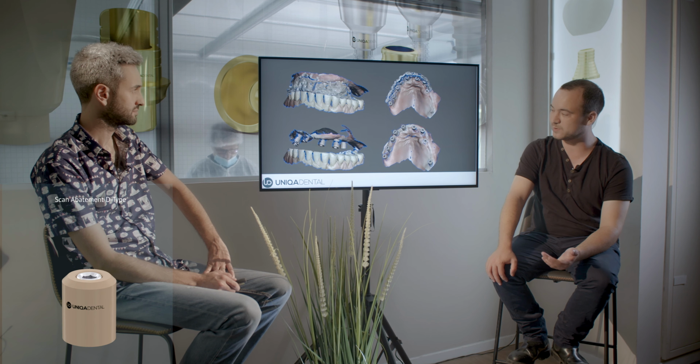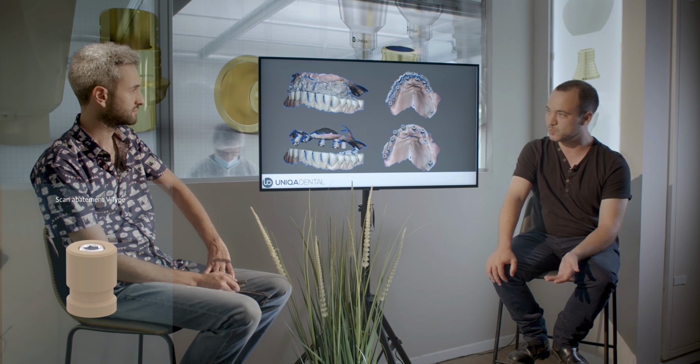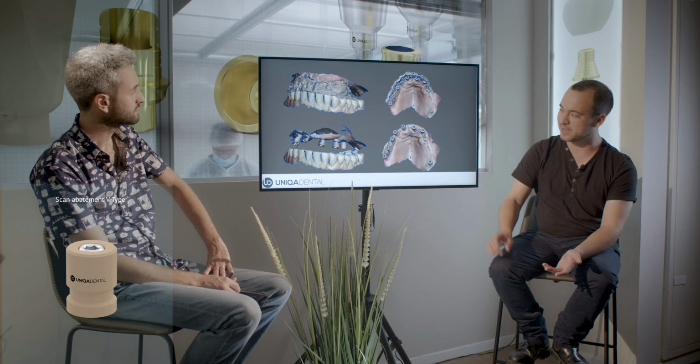If it was a traditional method, what we would do, we would take wax, we would know the height, we would know the central line, we would know different elements using wax. But if you want to scan, if you want to use the CAD CAM advantages, you can't use wax.